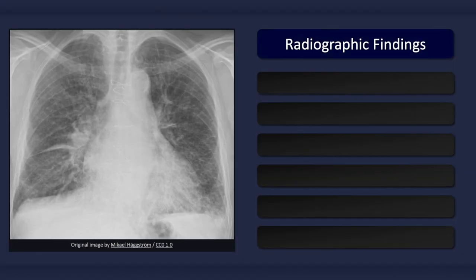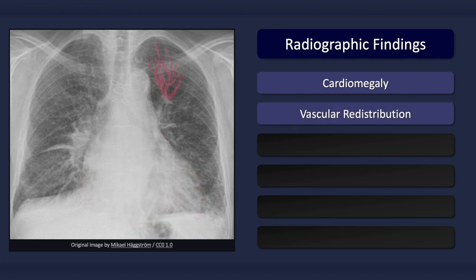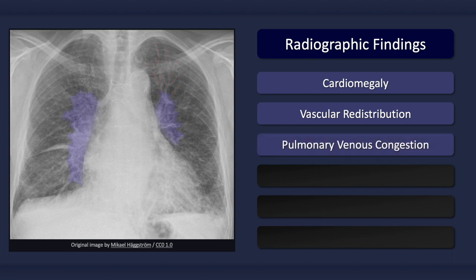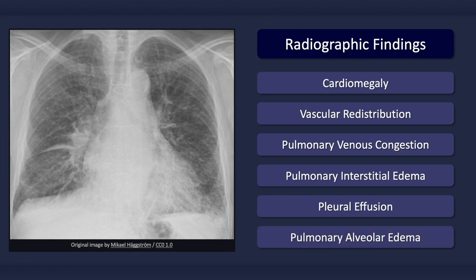Congestive heart failure can produce a myriad of findings on plain chest radiography. Which findings are present depends on the severity of the patient's condition. On an erect posteroanterior chest X-ray, suggestive findings include cardiomegaly, vascular redistribution — that is, the cephalization of blood flow — pulmonary venous congestion, pulmonary interstitial edema, pleural effusions, and in more severe disease, alveolar edema, which is not clearly evident on this radiograph.